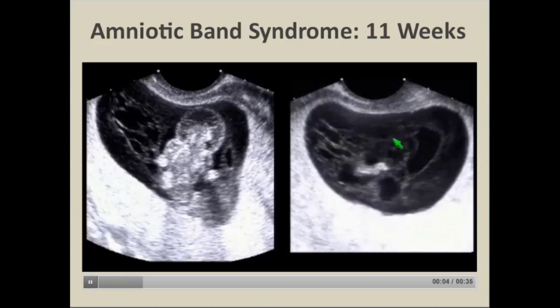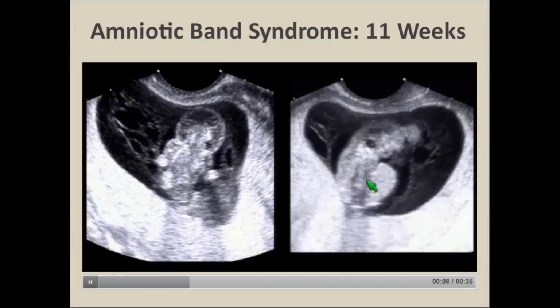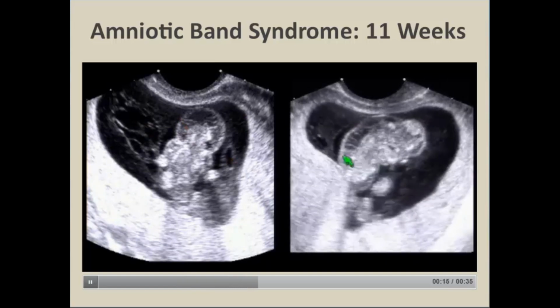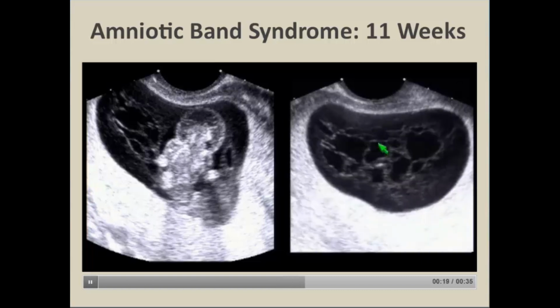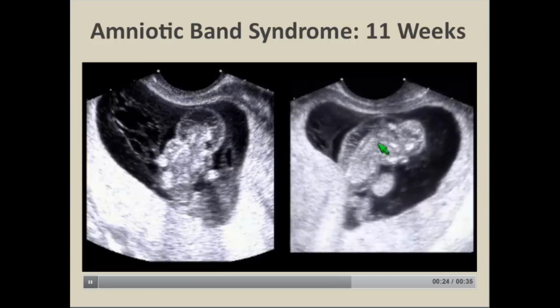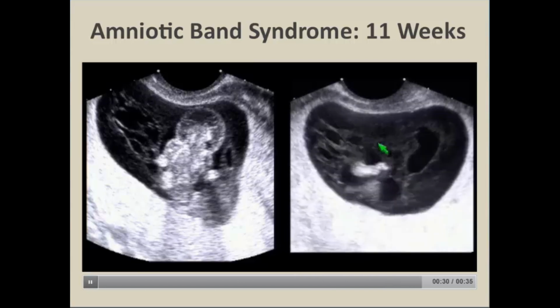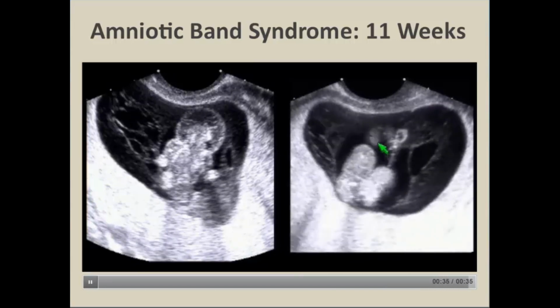The fetus is markedly distorted. You can see that the head is disrupted with protrusion of material superiorly. The trunk is disrupted with protrusion anteriorly. But also notice how these bands crisscross the gestational sac. These bands are not just the loose amnion. These are fibrous bands that develop across the chorionic space. And so it's not just that one membrane can attach to the fetus, all of these can, and entangle the fetus to lead to very severe, very devastating abnormalities.